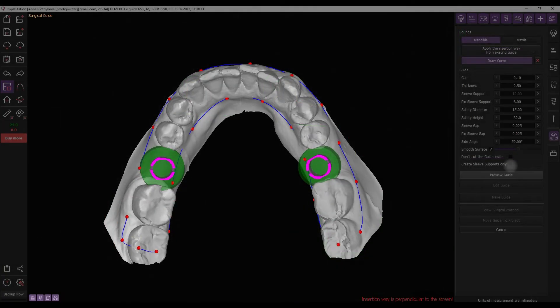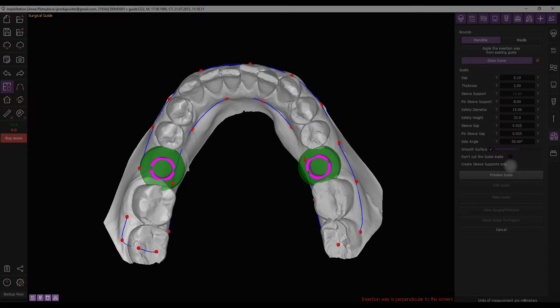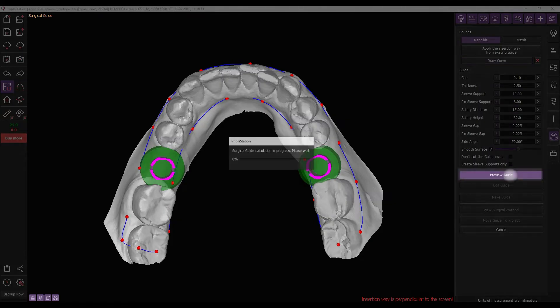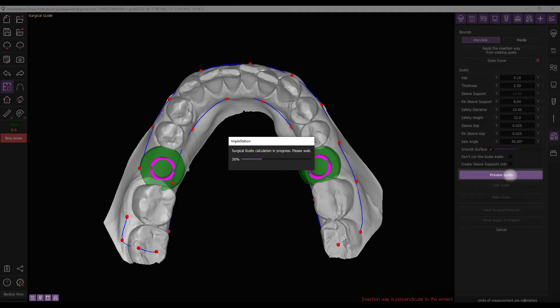After drawing the curve and setting the necessary parameters, position the STL surface in a way that minimizes undercuts, considering that the path of insertion is perpendicular to the screen. Click the Preview Guide button to generate a draft of the guide.